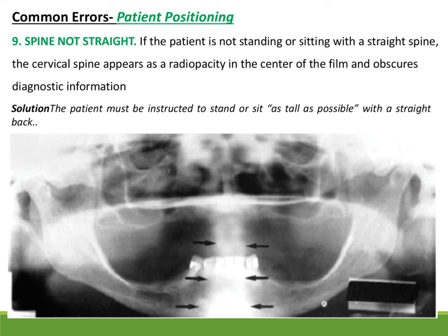So, if the patient's spine is not straight, you have to instruct the patient to stand or sit as tall as possible to get a good radiograph.